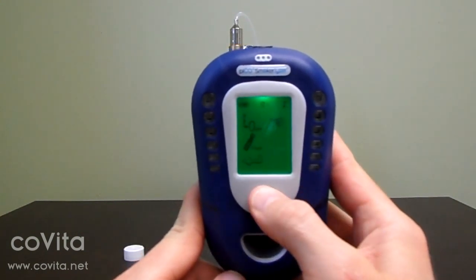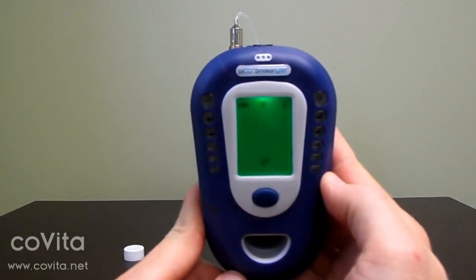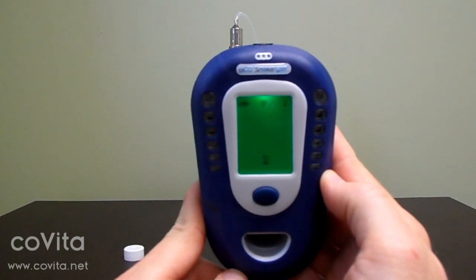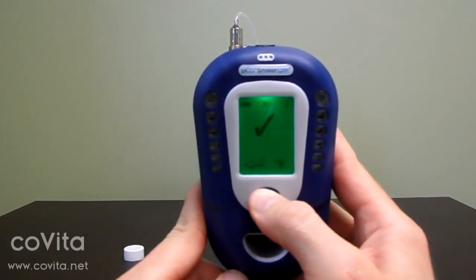On the next screen, double click to select the zero scale. Let the zeroing process cycle through with the hourglass until you get the check mark. Double click to return to the previous screen.